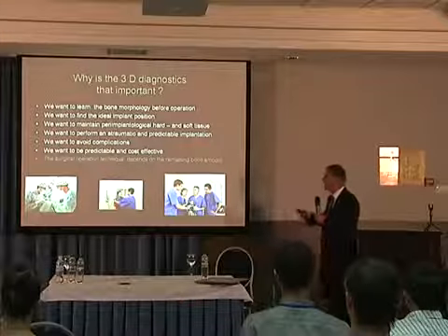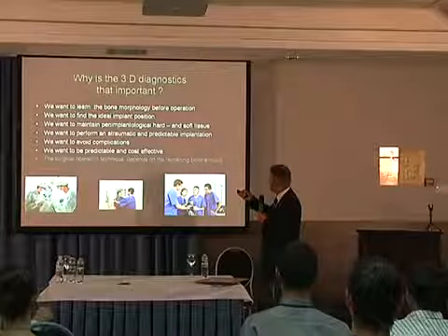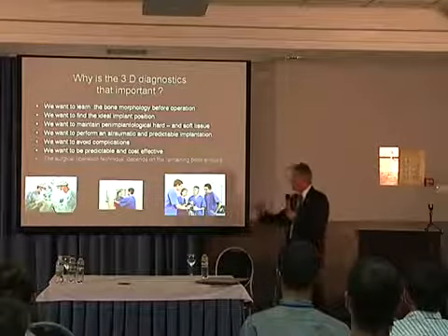The 3D diagnostic is the important key to learn about the bone morphology, the ideal implant position and the way we have to prepare our hard tissue.